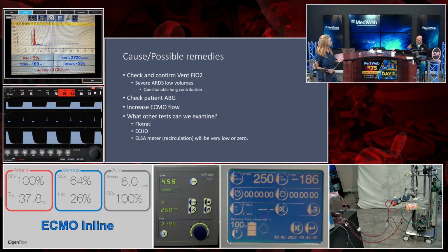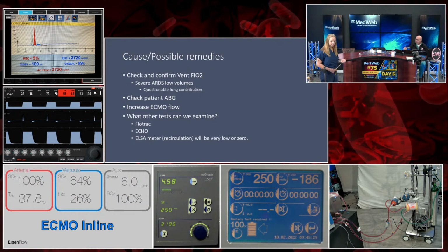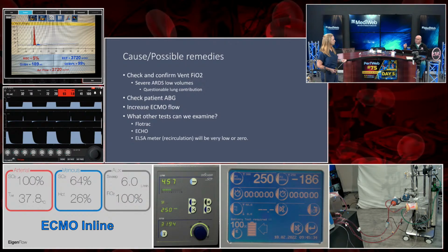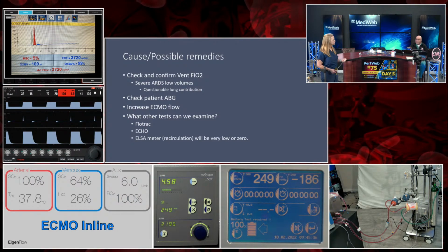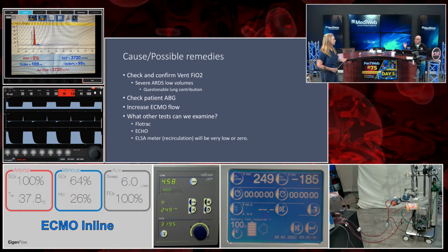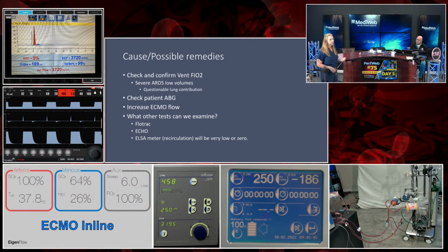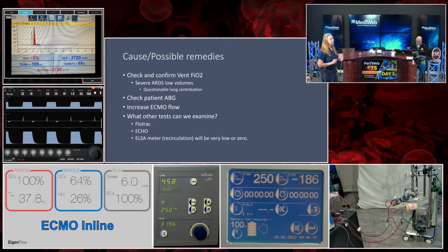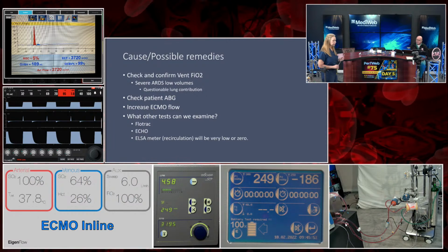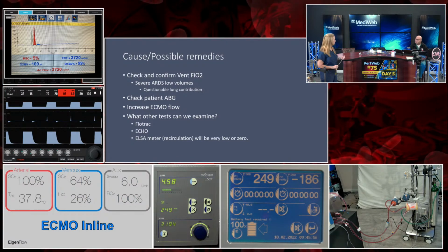And a lot of that is going to be due to cannula positioning. However, very important to understand, the higher your cardiac output in relation to your ECMO flow, the lower your recirculation will be, even in a not perfectly placed double lumen catheter. And something else to point out while we're talking about this: thinking that your recirculation can improve if you increase your flow is the wrong thing to think.